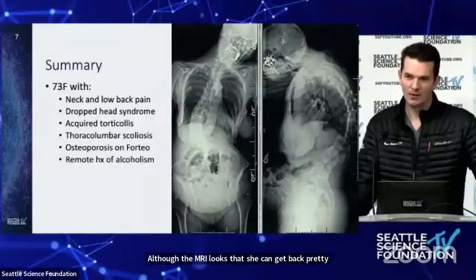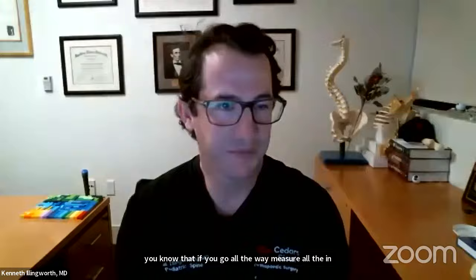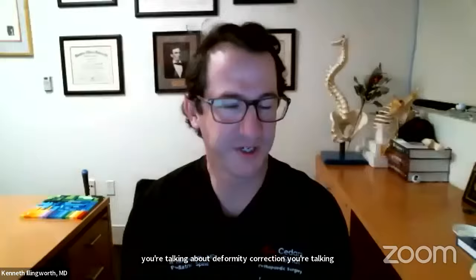And in looking at that X-ray, you would think that you might have some flexibility, but that looks to be a fairly significant kyphosis. That kyphosis is certainly more than 60 degrees. If you measure all the way into the lumbar spine, you're probably looking at more of a 90 degree kyphosis, and certainly there's going to be some rigidity there. If the patient's severely symptomatic and you're talking about deformity correction, you're talking about quite an extensive procedure. That cervical kyphosis is a bit of an issue in terms of where you're going to stop your UIV, but this patient probably needs an extension up into the cervical spine if you're talking about deformity correction.